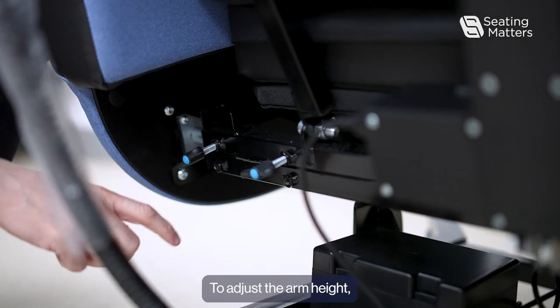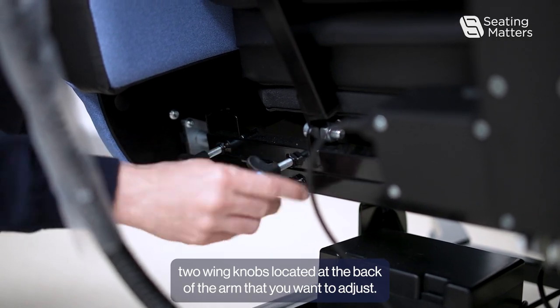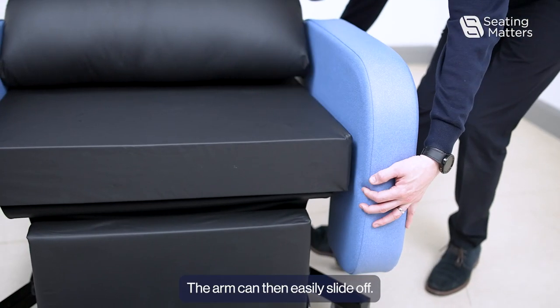To adjust the arm height, first you'll need to loosen the two wing knobs located at the back of the arm that you want to adjust. Then you will need to loosen the two wing knobs located at the front of the arm. The arm can then easily slide off.